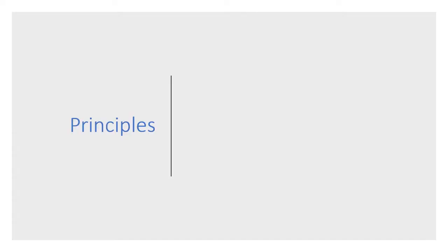As we start to discuss the principles of lung ultrasound, there's really a few key points that will help you put everything together and understand it as we go. So first of all, it's important to remember that air is bad for ultrasound. In a normal lung, we cannot actually see the lung because the air inside the lung disperses the ultrasound beams and they can't actually produce anything meaningful.